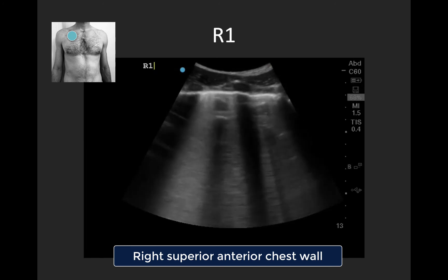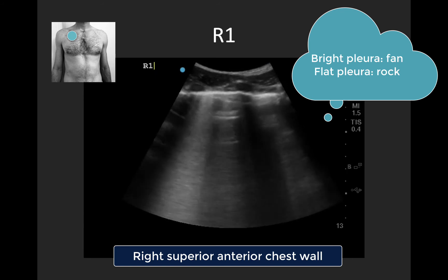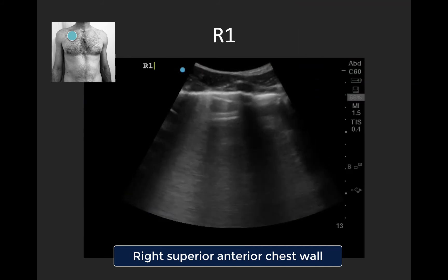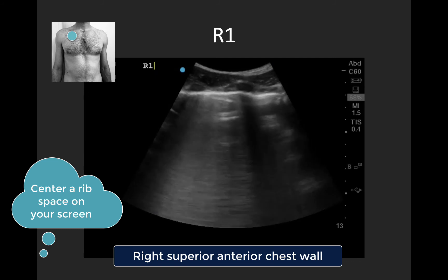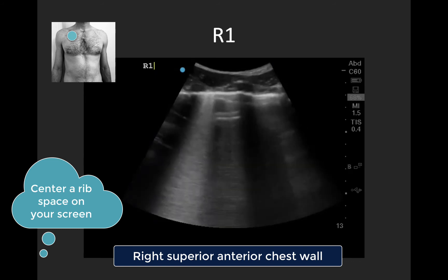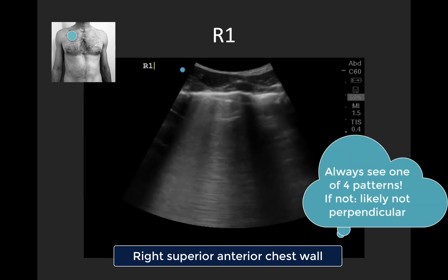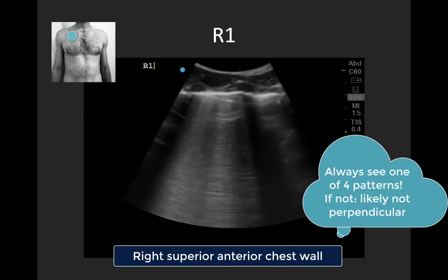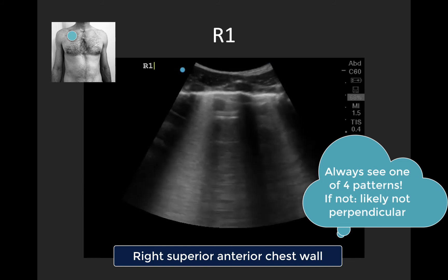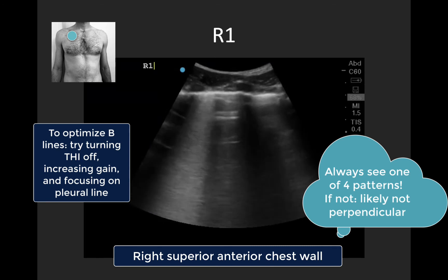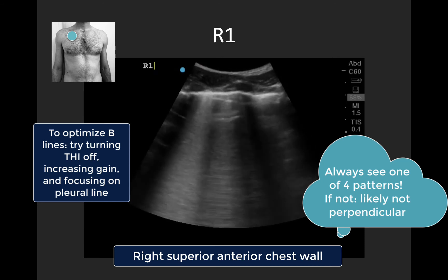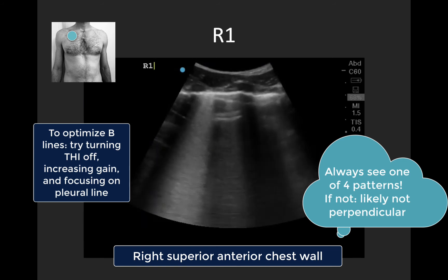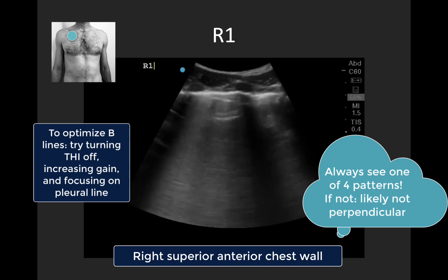A couple more technical pointers: we ideally want the pleura to lie flat and horizontally on the screen, which can be facilitated by rocking the probe. We also want to try to center a rib space in the middle of our screen — with a phased array probe you'll typically capture one rib space per clip, whereas with the curvilinear you often get two. Always remember you should see one of four patterns. If all you're seeing is gray fuzz, it's usually because you're not perpendicular to the pleura. Fan your transducer until you see a bright pleural line with either A or B lines beneath it.